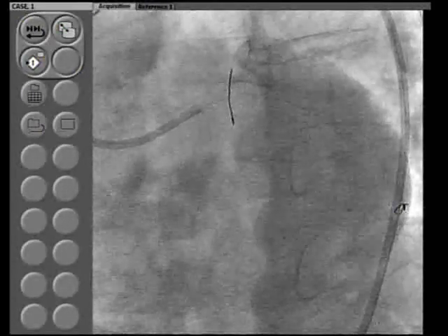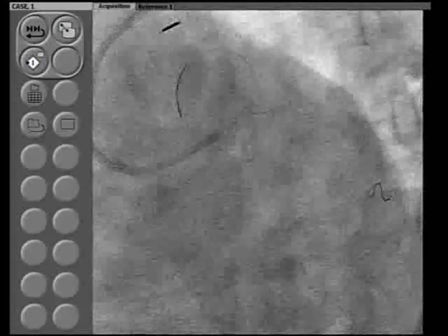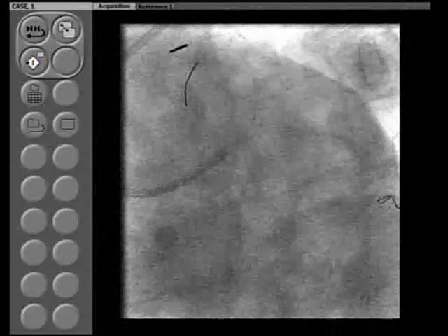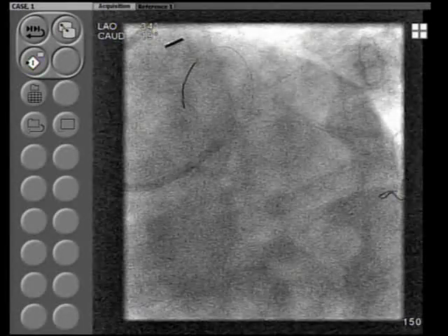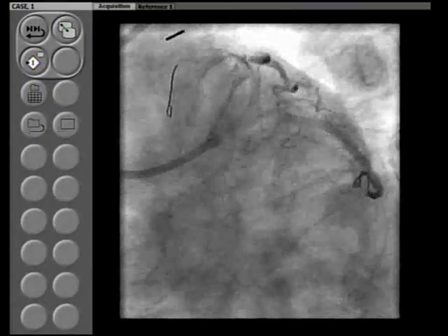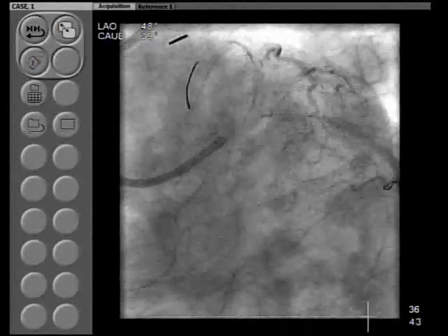Now, angiographically, we can say that in this case we would actually have been done. But since we now know, and whether it will translate into lower restenosis in the future is a different issue, since we have used the IVUS and follow the IVUS data, we'll go back and just dilate the ostium of the LAD further.